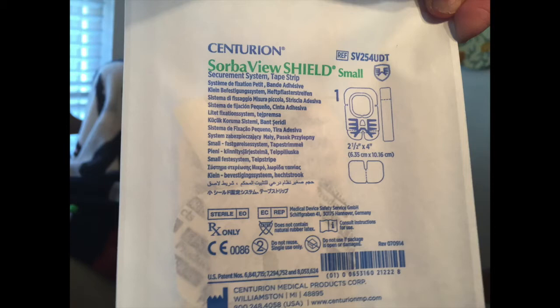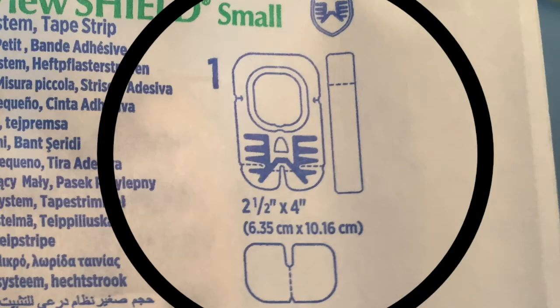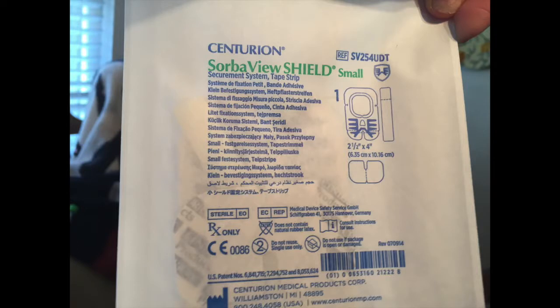This is the first patch I put on before we do the bigger patch. Everybody does their dressings in different ways — I put two patches on my central line. For this one, you need a stat lock to hold it in place, even though it is also held in place inside you. The stat lock is that blue striped thing that kind of looks like a skeleton on the patch picture. That sticker goes on top when you're done, and it locks the line in so it doesn't fall out as easily.